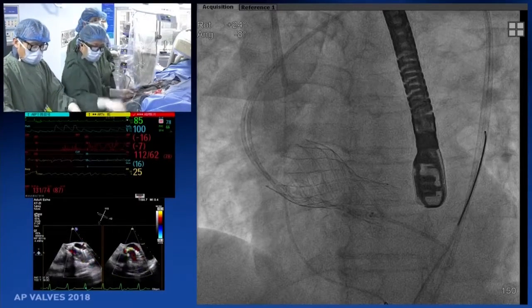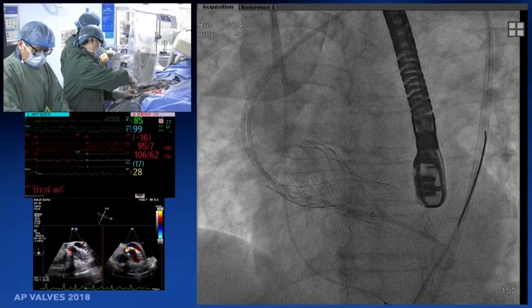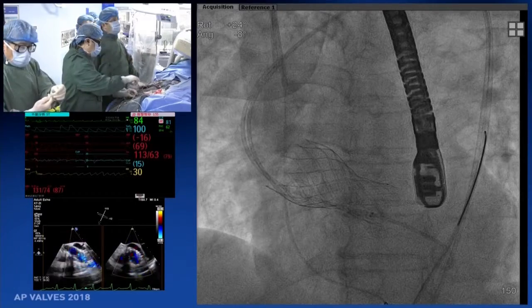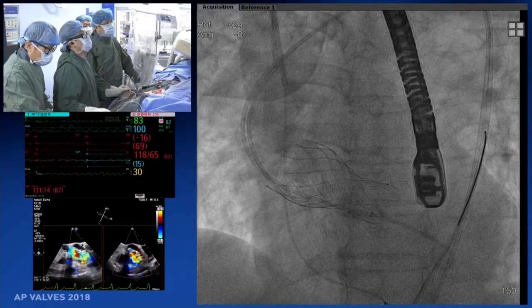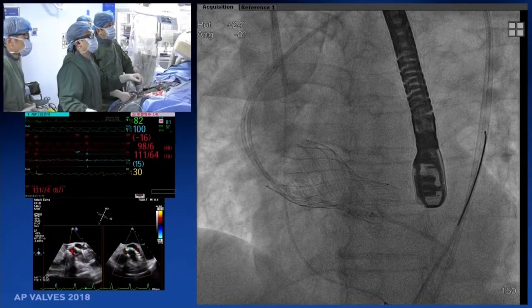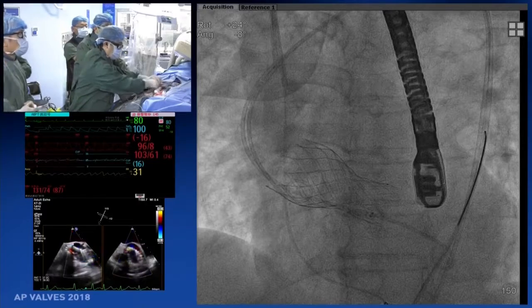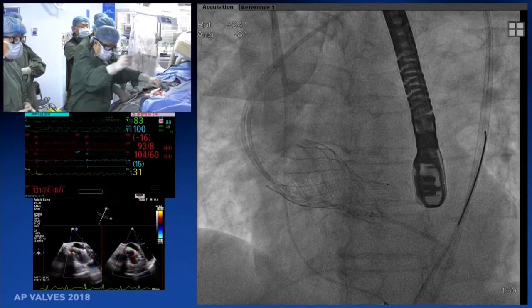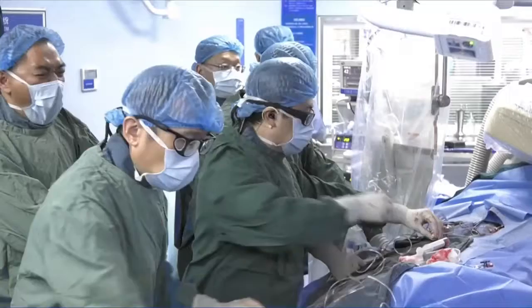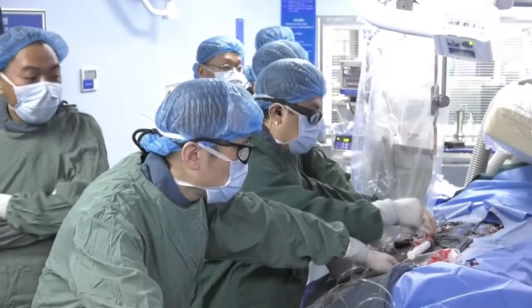So talking about diastolic pressure, I remember many cases where we had significant pressure. Diastolic is 113 over 65 acutely, and then later on 118 over 65. LV? Hard to see the pressures. We cannot really see the pressures here. It's very dark. 113 over 64. No, but look at the waveforms.